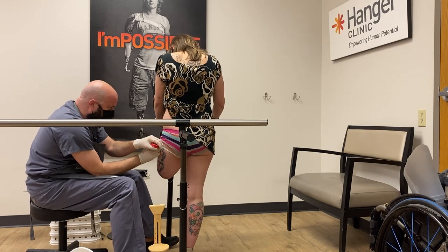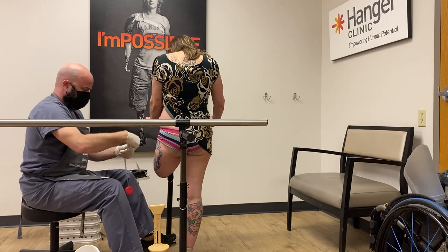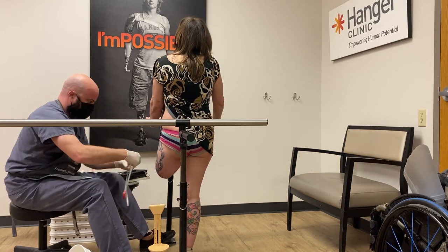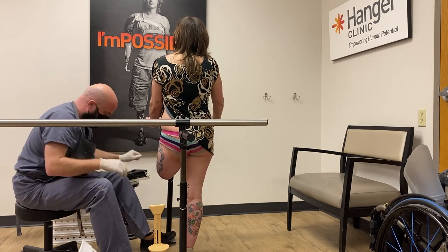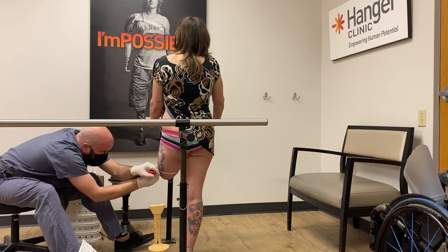These measurements he is taking right here are important because when he makes the positive of my residual limb, he will be able to measure that positive and make sure the measurements correspond to my residual limb measurements. If you are interested in seeing an extended cut of this video — it's about 28 minutes long — you can find that on my Patreon.